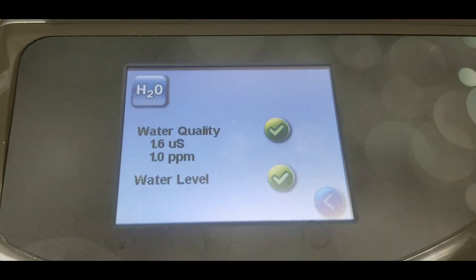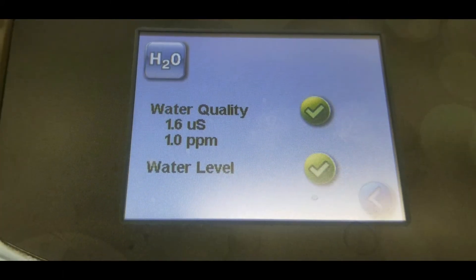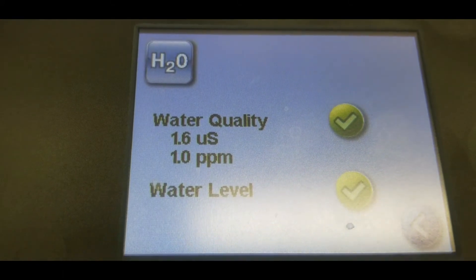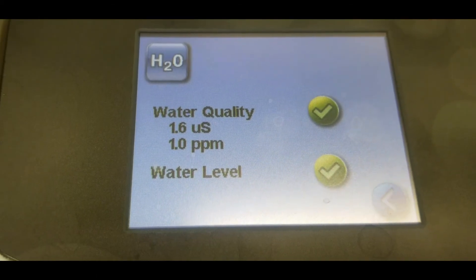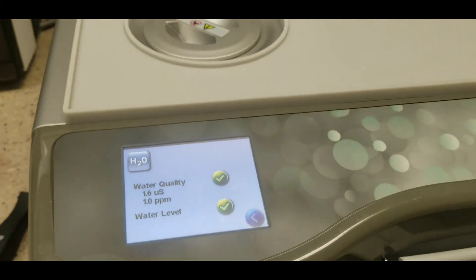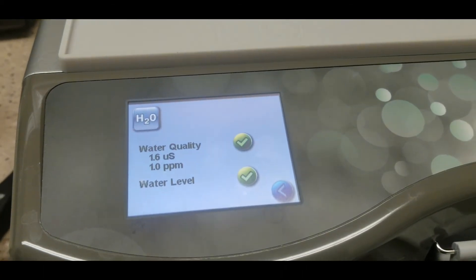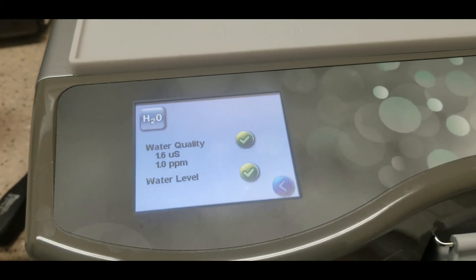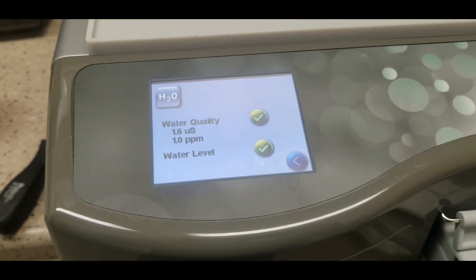We've refilled the tank of the Statim, and it's now showing water quality is still acceptable with a green check, but it's at about one part per million — so maybe a TDS level of one. There's probably just a tiny bit of minerals remaining from the water that was at TDS 75. As we run more pure water through at TDS zero, that should clear up.